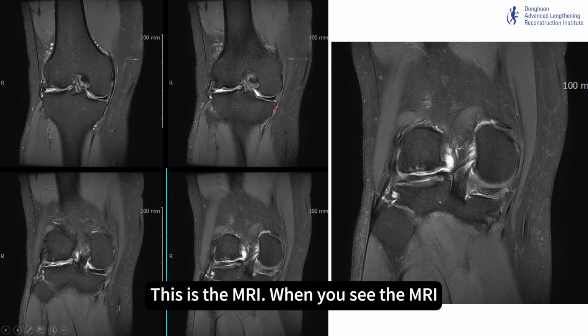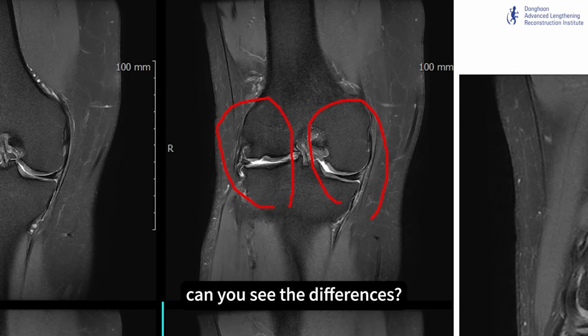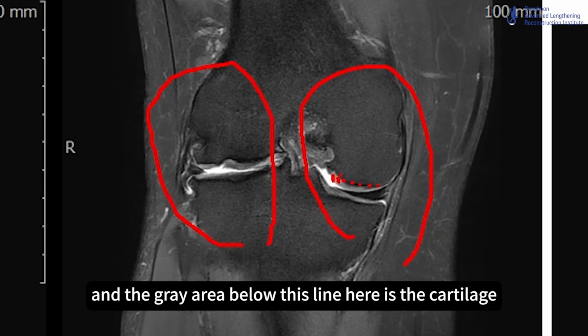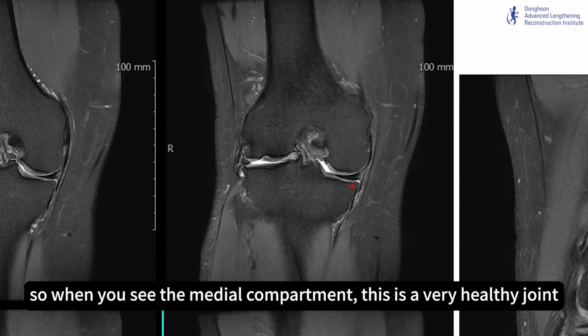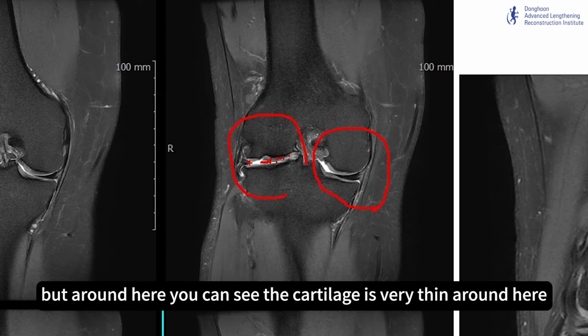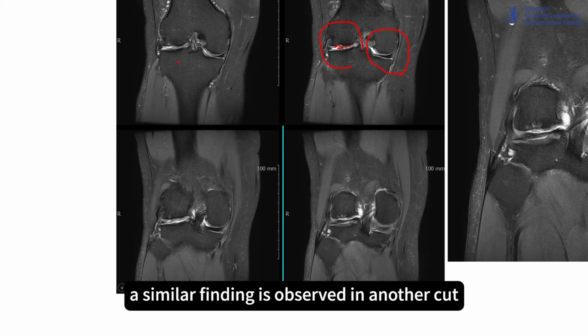This is the MRI. When you see the MRI, this is the medial compartment and this is the lateral compartment. Can you see the differences? Here, the black line is the end of the bone, and the gray area below this line is cartilage. Here is also cartilage. So the medial compartment is a very healthy joint. But in the lateral compartment, here is healthy cartilage, but around here you can see the cartilage is thinned, and we can see a defect of cartilage. A similar finding is observed in another cut.